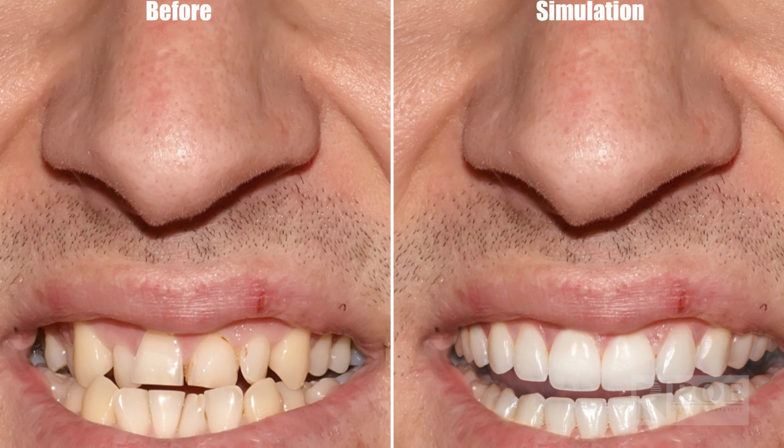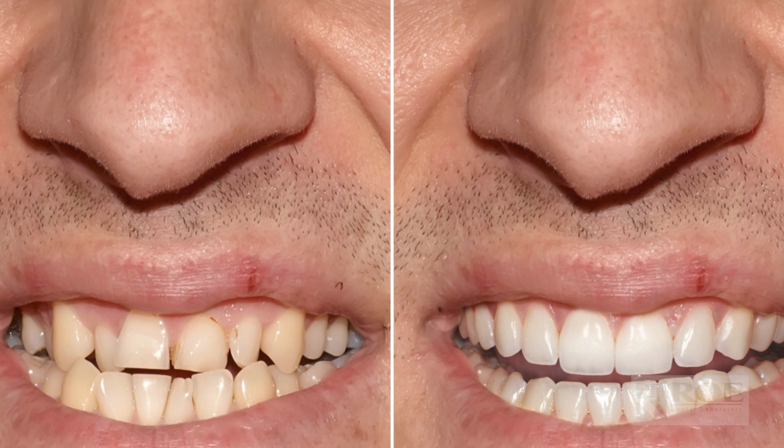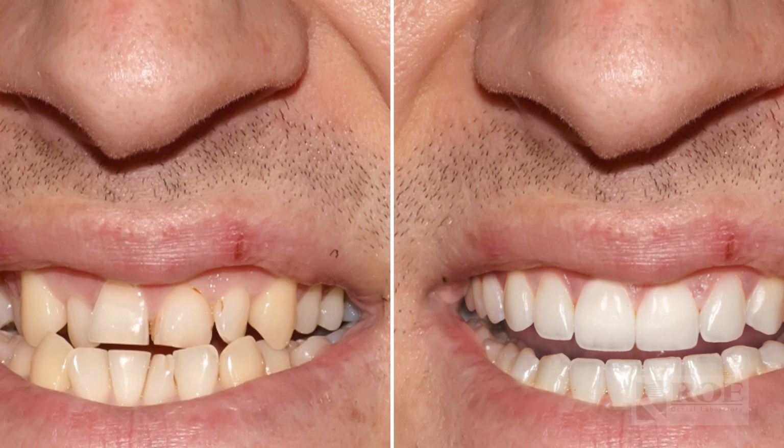You create a PreVu, you use it as what we call an educational mock-up. You can show people that their teeth have worn down over time. You can show people that their teeth are not in alignment and it might be affecting their gingival health and their overall health or their bite, and you're concerned about that. So in a new patient exam, it's extremely effective because again, it's really quick to create. So it's almost similar to using an intraoral camera to show people broken down amalgams and things like that.